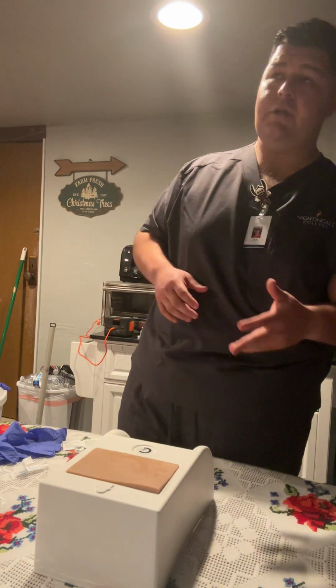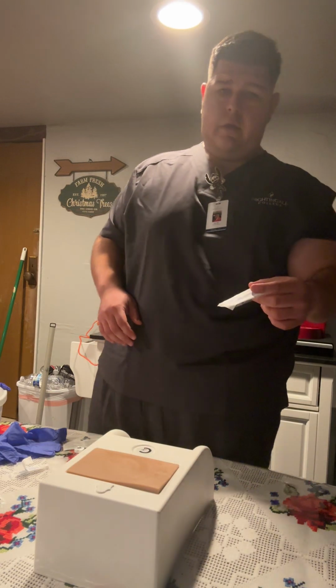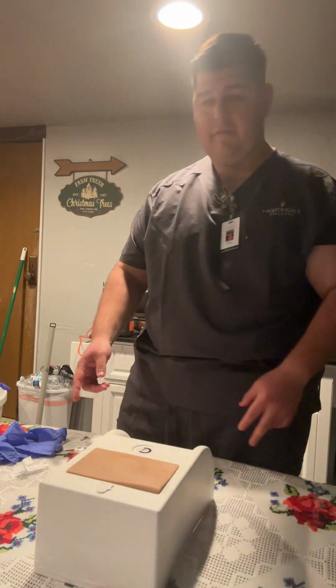To start off, I gather my supplies. First, I have my medication vial, a pair of gloves, gauze, and alcohol wipes. Next, I have a syringe and a needle. I want to point out I'm using a 3 milliliter syringe. I could use either a 22 gauge or a 25 gauge, which for this case I'm using a 25 gauge, 1 to 1.5 inch needle. My equipment's already open and used. I wanted to point that out as well. They're used from practice. So essentially my supplies are ready to go.